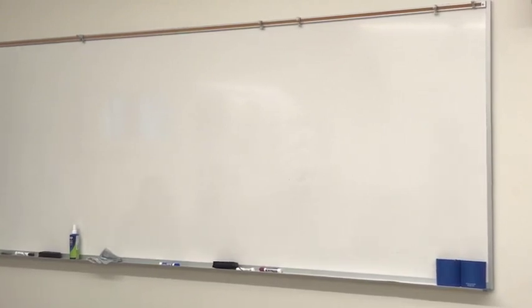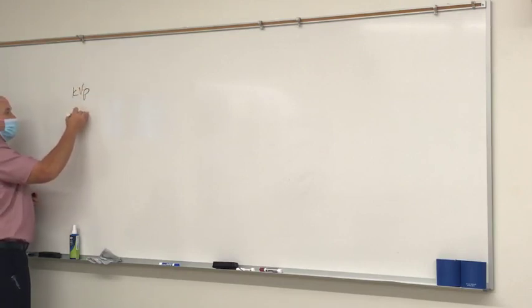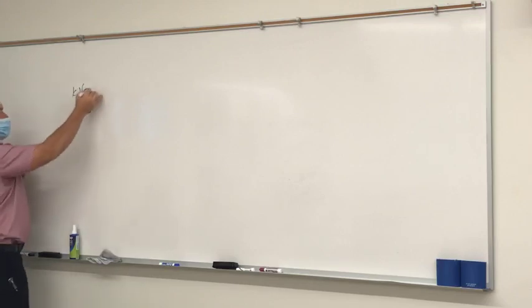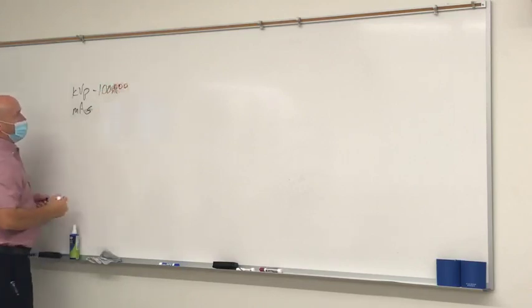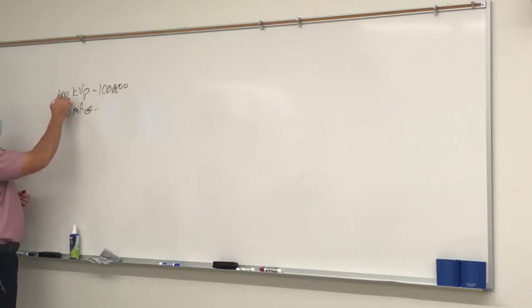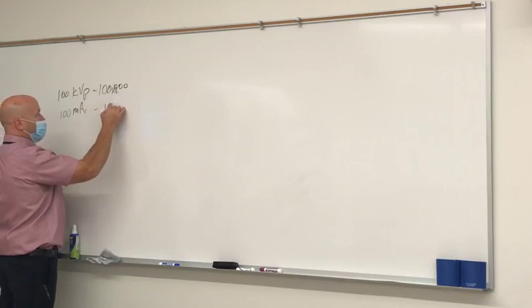when we're talking about X-ray creation, we're talking about kilovoltage and, okay, we've got kVp and we've got milliamperage. Yeah, milliamperage. Okay, so kVp is 100,000 volts. Well, let's say 100,000 volts. Let's say for 100 kVp. So if we have 100 mA, then we're going the opposite direction. 100 kVp is adding 3 zeros. 100 mA would be 0.1 amps.